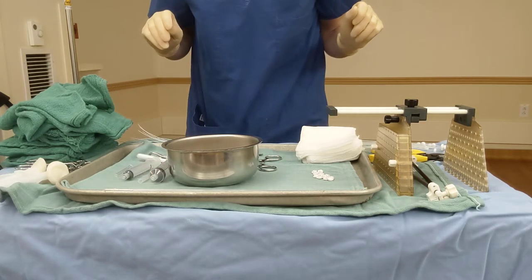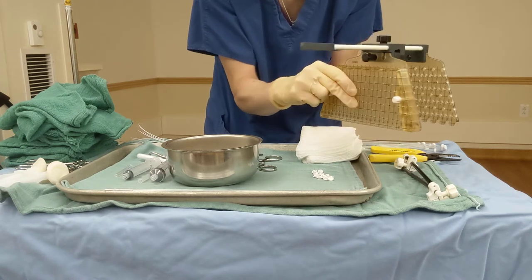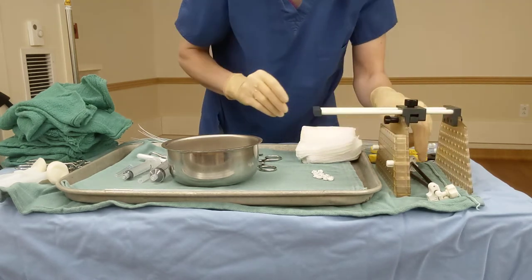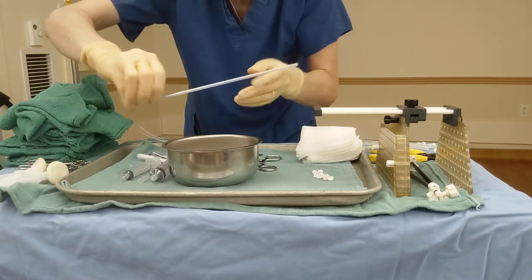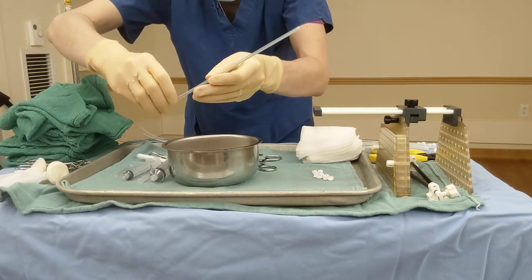We have our template, which has been assembled correctly and beautifully, and we have got our needles. These are in a protective plastic sheath.